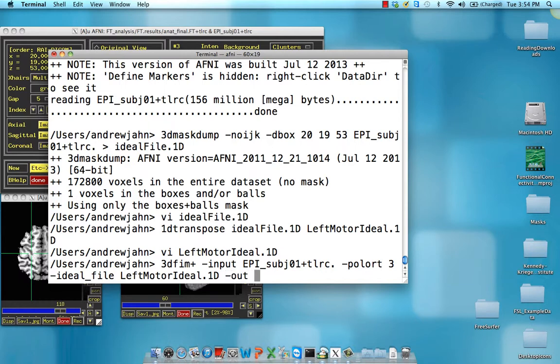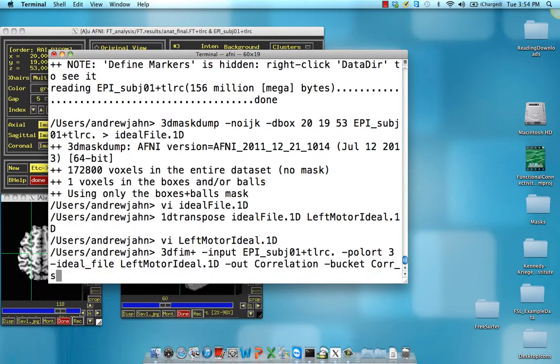We can output a bunch of different types of data, or a bunch of different types of statistics. In this case, let's just output the correlation and see the help file for other types of data that you can output. And the bucket is going to be called Corr underscore subject 01.